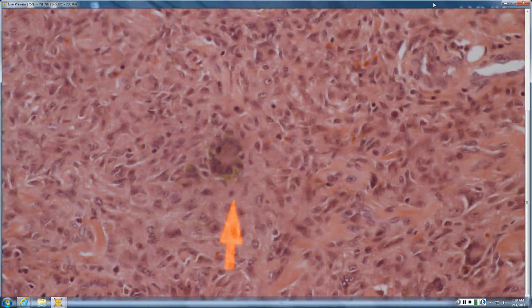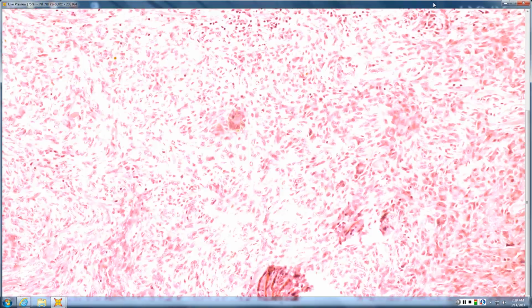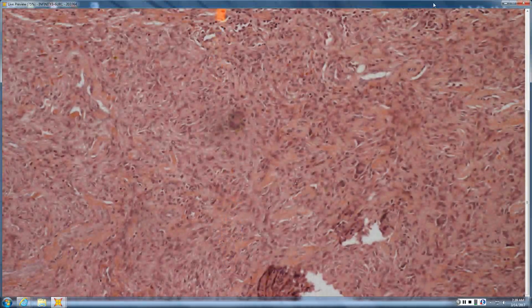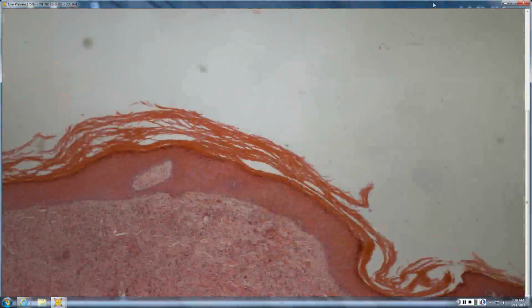So with big DFs, you may have to look for some of the clues. They may not have very prominent collagen trapping. In that other cut, is that just artifactual, like at the top at the dermis, where there's that destruction in that area that you're seeing?